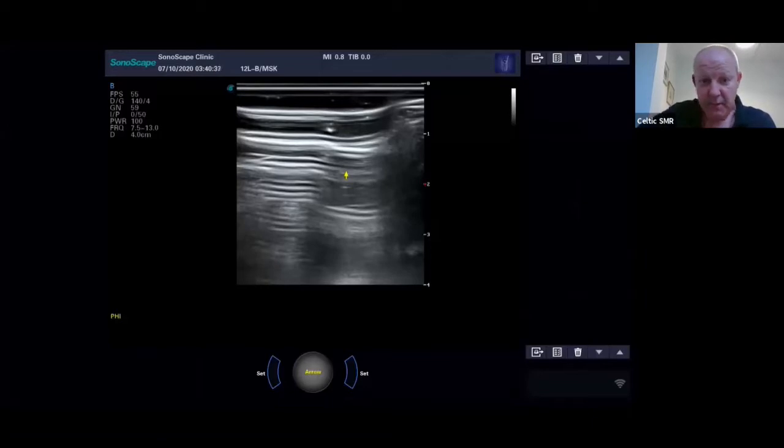But it's probably easier to find. It's quite difficult to find it from the medial side. But you don't get many requests for distal biceps. Obviously, it's usually a traumatic thing, so they don't come in that often. But yeah.